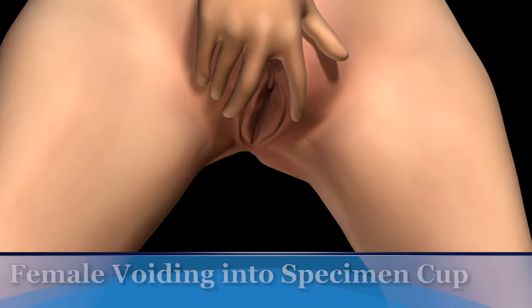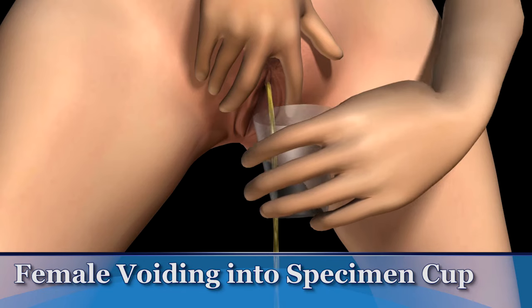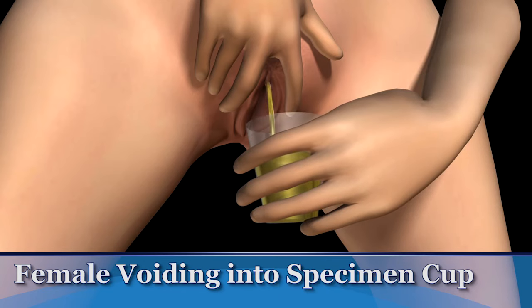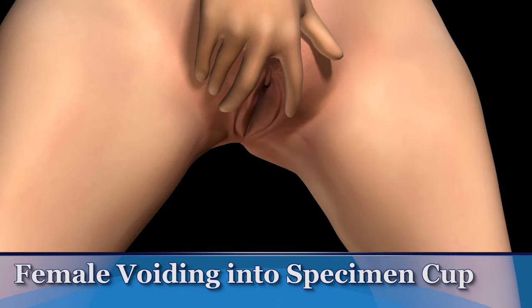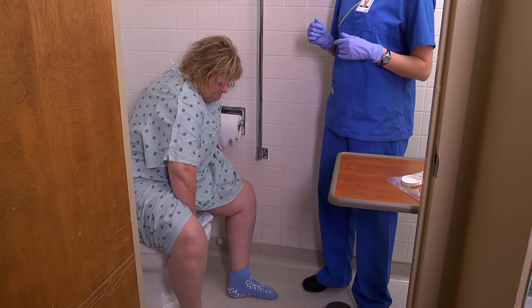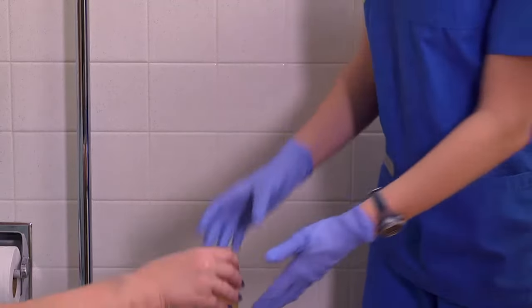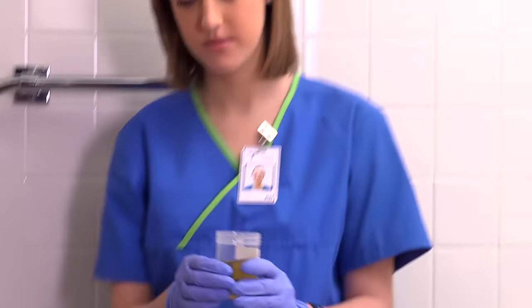While continuing to hold the labia apart, ask the patient to begin urinating into the toilet or bedpan. Then pass the specimen container into the stream and collect 90 to 120 milliliters of urine. Have her remove the specimen container before the flow of urine stops and before releasing the labia. Allow her to finish voiding into the bedpan or toilet and assist her if she needs any help with personal hygiene.